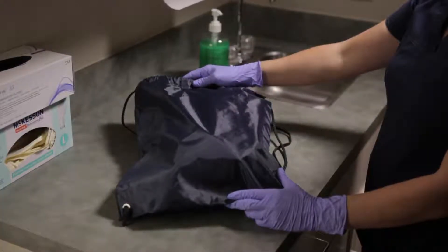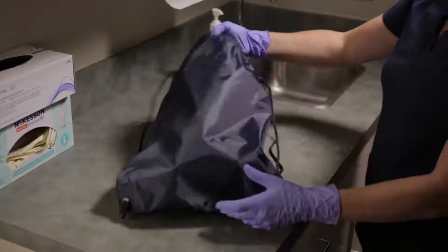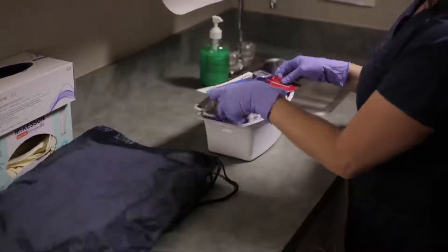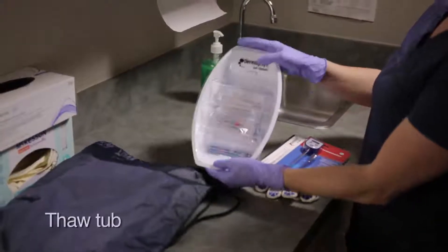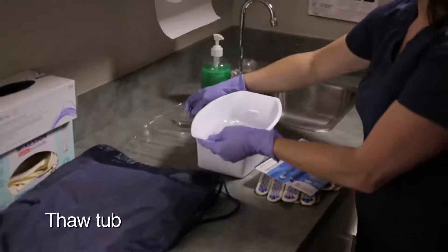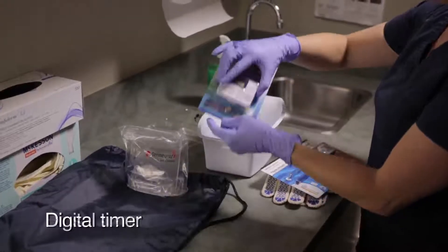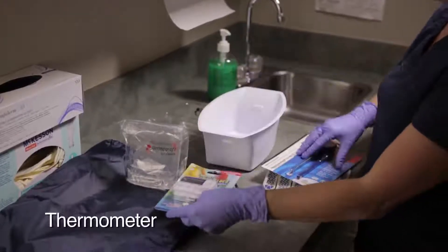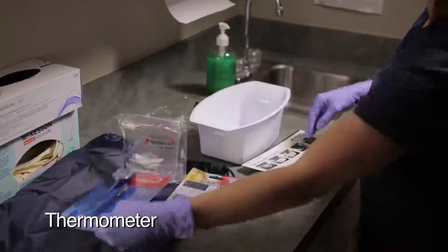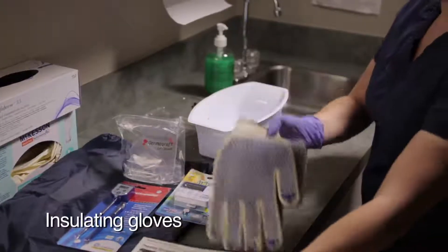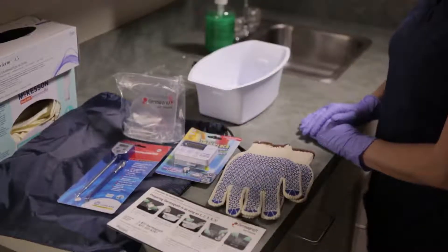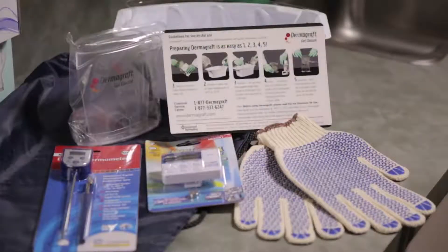The essential items needed to prepare Dermagraft are provided within the reusable thaw kit. The kit consists of the following items: the thaw tub and lid, Dermagraft rinse stand, digital timer, thermometer, preparation card and insulating gloves. A thaw kit will be provided on your first order of Dermagraft, attached to the outside of the shipper. Additional thaw kits may be requested from customer service or your local representative.